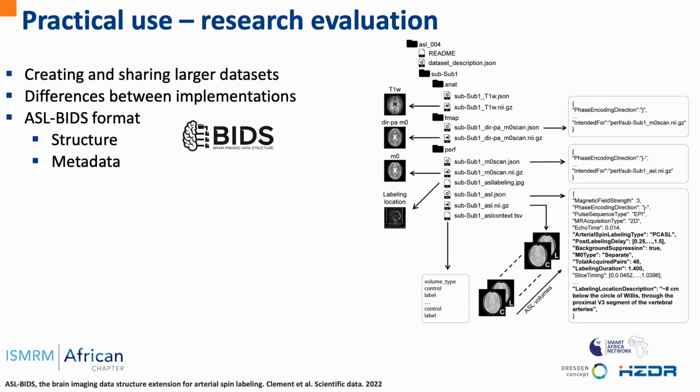However, there are still issues with conversion from DICOM, as not all ASL tags are saved in DICOMs. And while there are some pipelines that already support processing data saved in BIDS, the support is still not universal. So while I would nevertheless recommend saving data in the ASL-BIDS format, you still have to wait a bit until all conversion tools and all processing software support it.